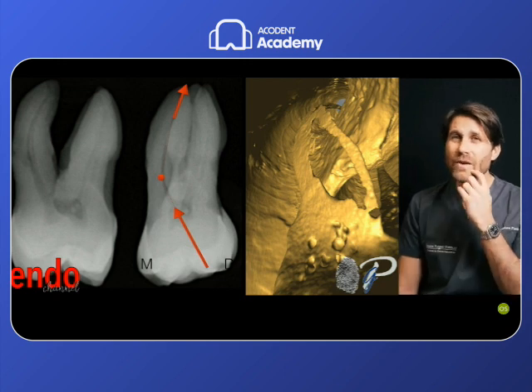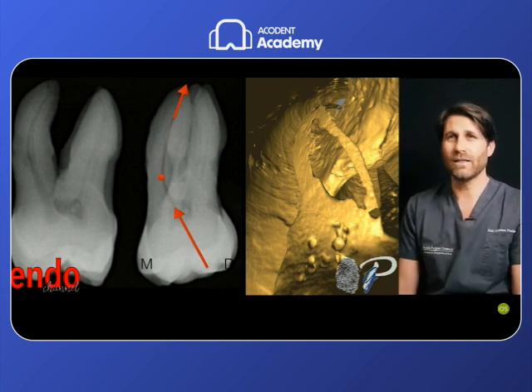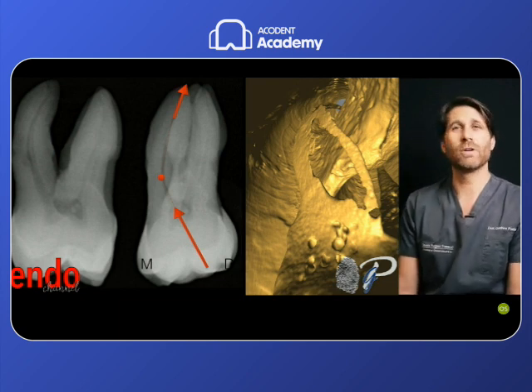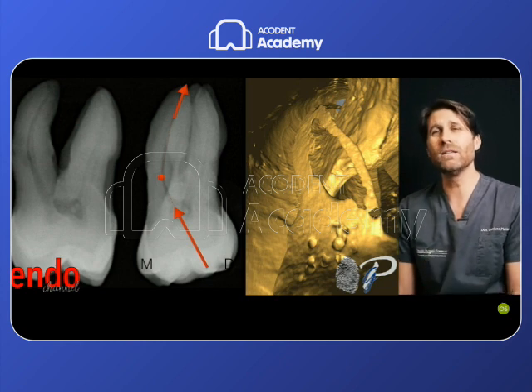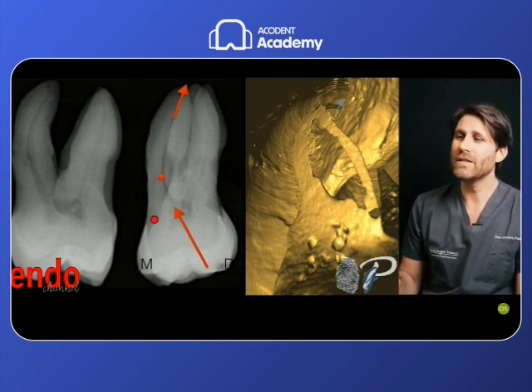So as soon as we found the orifice, I want an instrument that permits me to immediately scout this orifice without the need to go deeper inside the root with more aggressive techniques like burrs or especially ultrasonic tips. So as soon as I find an invitation, I want to treat this orifice as soon as possible by mechanical files.